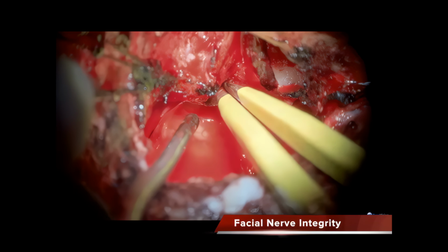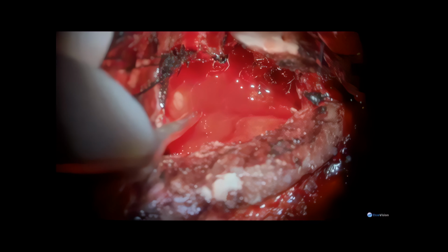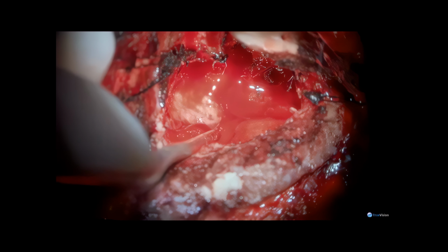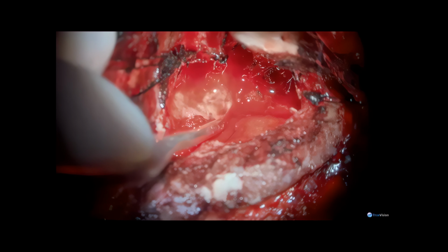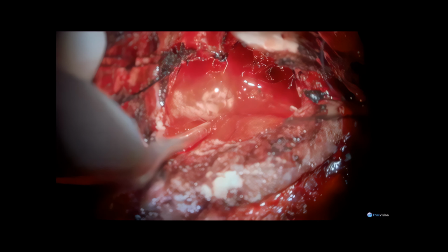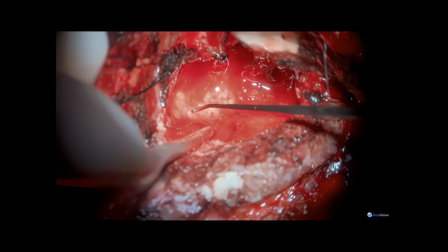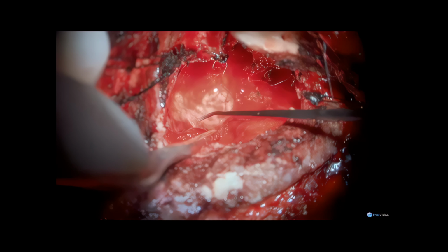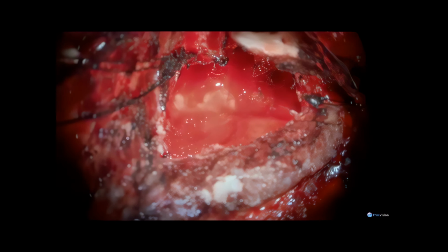Facial nerve anatomic and electrical integrity is verified by the use of a continuous EMG facial nerve monitoring system. Here I am stimulating the facial nerve at its root entry zone into the brainstem, confirming anatomic and electrical integrity.